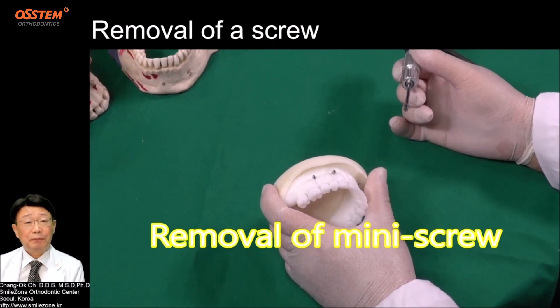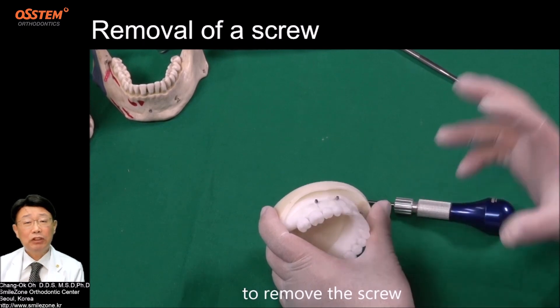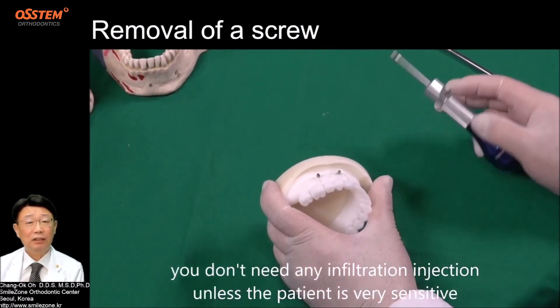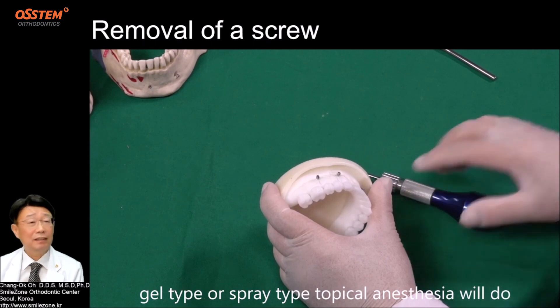Removal of a mini screw. Removal of a screw is not difficult. To remove the screw, you don't need any infiltration injection unless the patient is very sensitive. Gel type or spray type topical anesthesia will do.